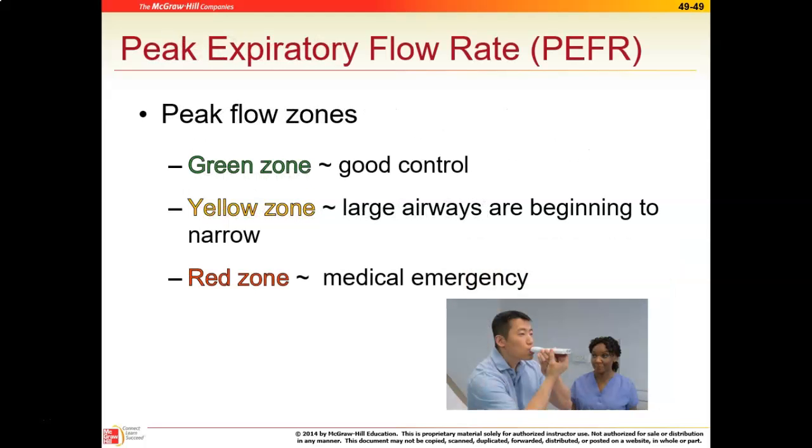I'm going to be able to give everyone a peak flow to take home and work on, since we can't really be taking our masks off and breathing without our masks in a closed room together. I'm going to send you home with a peak flow meter and have you demonstrate it. Just take a quick video for 30 to 60 seconds, demonstrate it, and send it to me, and that's how we'll go through it and mimic this particular instrument use.